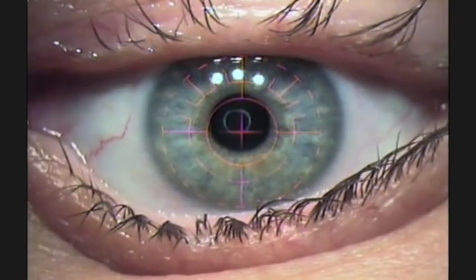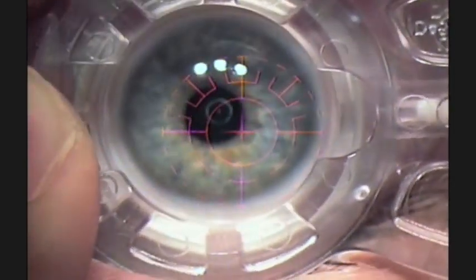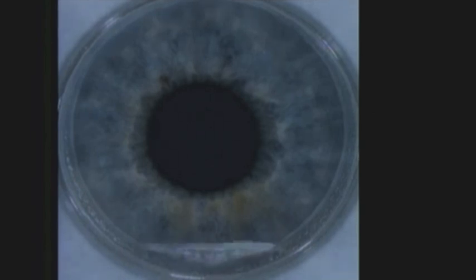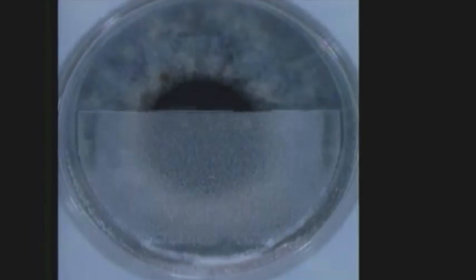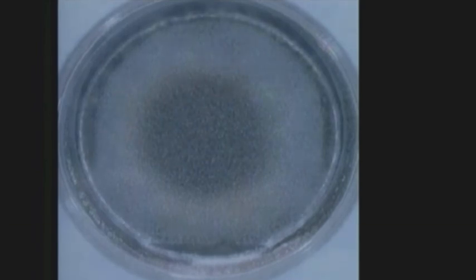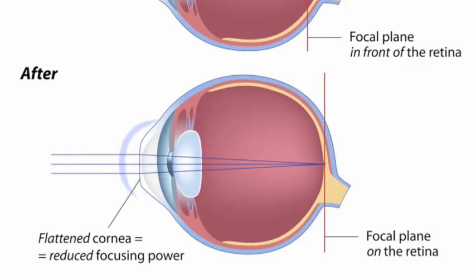Here we have the patient's eye, and the first step is to put a suction ring onto the eye in order to keep the eye steady while we do the femtosecond laser. The femtosecond laser is a very special laser — it is ultrafast, creates pulses of about 30,000 pulses a second. What it does is form bubbles which connect and allow tissue to be divided on a molecular level. It's clean, it's cool, and there is absolutely no pain involved with this procedure. Once the flap has been made, the next step is to lift the flap.